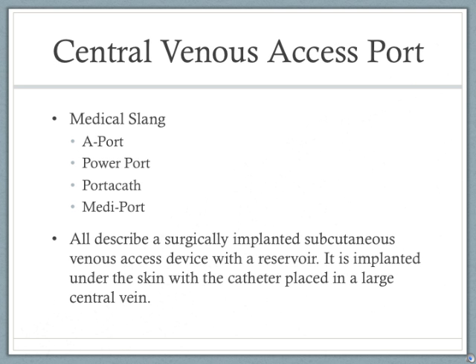Most of us have run into a central venous access port before, but either didn't know it was there or didn't really know what to do with it. It's called a lot of different things depending on who tells you, be it different providers, patients, their family, sometimes known as an A-port, a power port, portacath, a Mediport. Some of these are name brands, some of these are specific features of the device, and some are just what someone's used to calling it over the years.